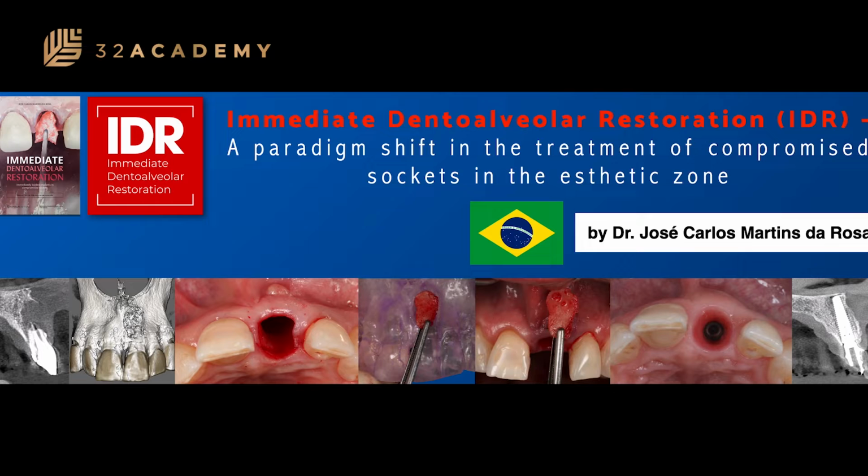Everybody knows that this technique is a paradigm shift in the treatment of compromised sockets in the esthetic zone. That's why I would like to invite you to come with me on this trip to modern implantology.